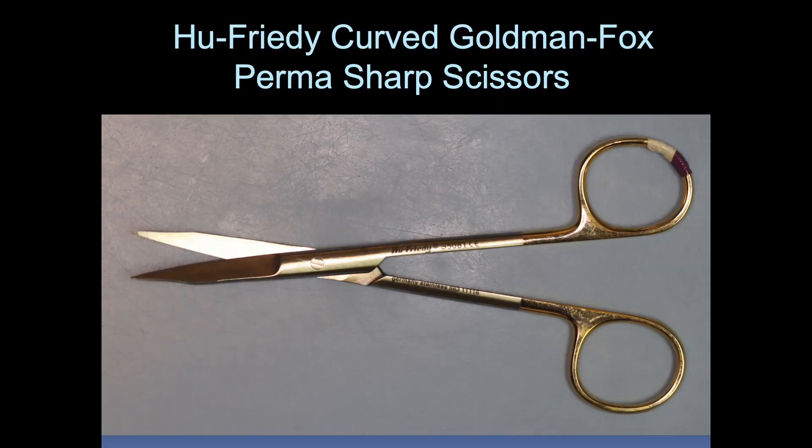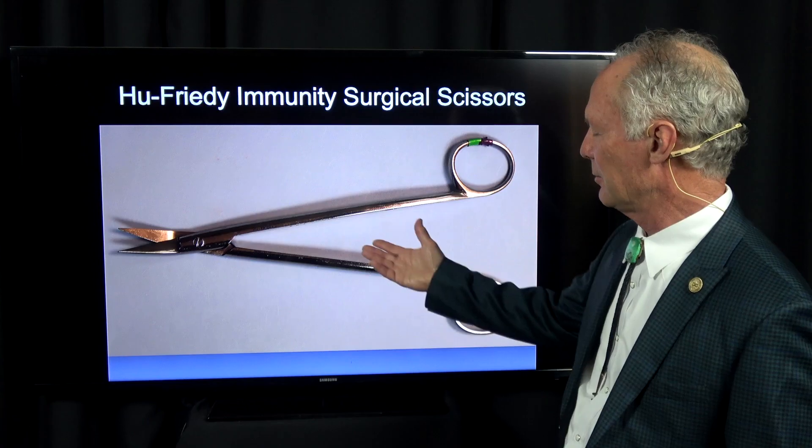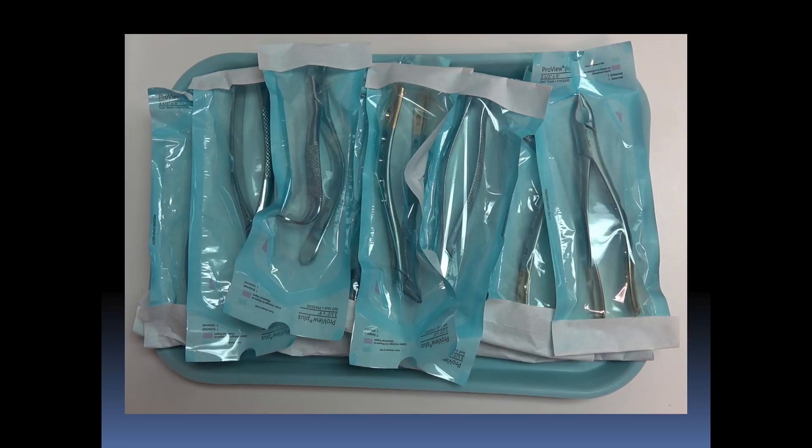Hemostats — this is for suturing. Scissors for cutting tissue or cutting suture. Another pair of scissors with a long handle, kind of curved at the end, for cutting suture.